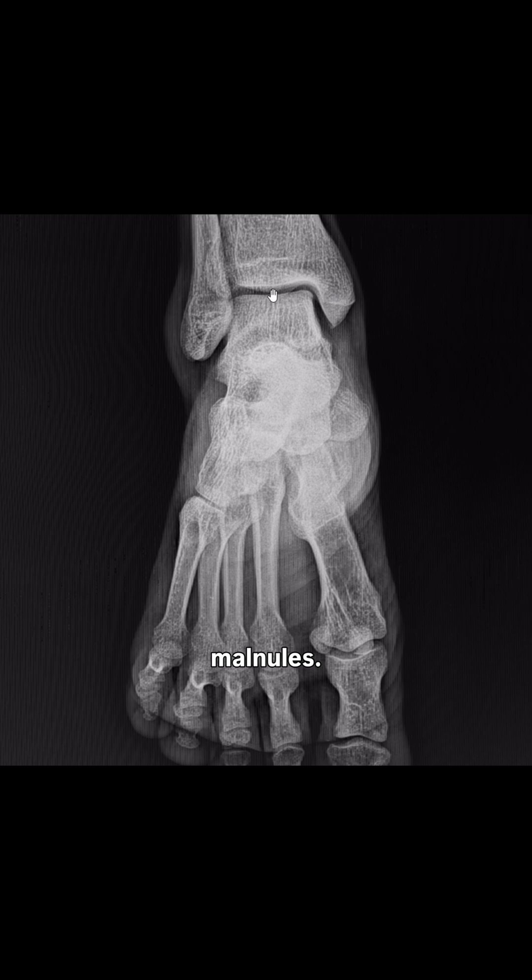The lateral malleolus has this as the articular surface, and this scalloping is for the attachment of the ligaments. This is the talus — its superior border makes the ankle joint. So this is a normal X-ray.